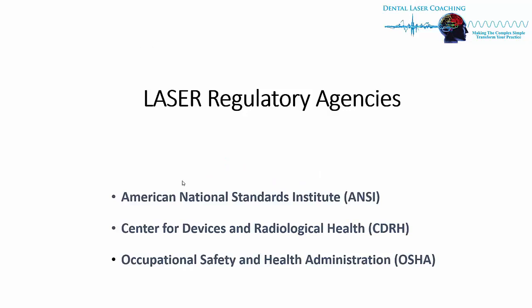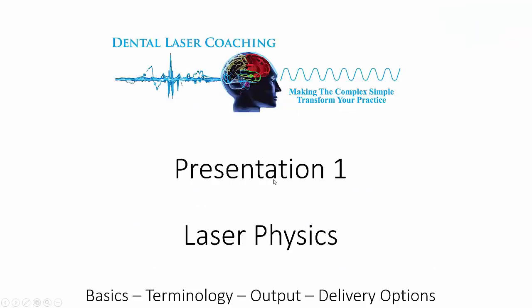So that's just a summary of some of the laser technology, and these bodies are governed by different agencies, and these are the ones that you'll deal with in dentistry in regards to OSHA and the Center for Devices and Radiological Health, and the American National Standards Institute come up with all the standards for medical and dental lasers. So that's the conclusion of the first presentation on laser physics.